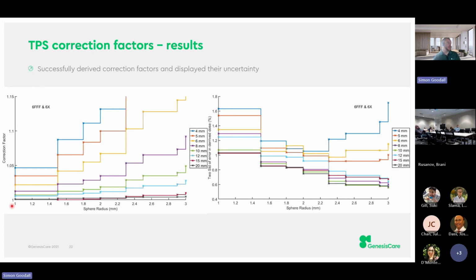These are relatively bland charts unless you're actually trying to use them at the time, but we successfully derived some correction factors. What we could see is that for these small fields, the correction factors are really quite low until we start moving into this 12, 10, 8 millimeters, the real extremes of SBRT or SRS. And fundamentally, when we get down to 4 or 5 millimeter fields, these factors become really quite high. They exceed 5% pretty quickly. So that's probably not a useful area to use them in.